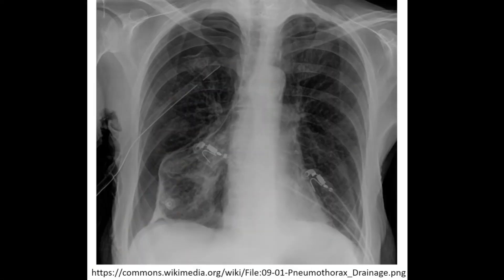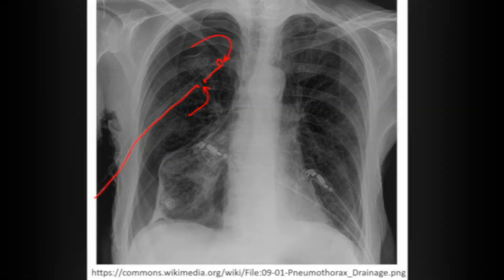Here you can see what a chest tube looks like on a radiograph. You can see the chest tube, and I'll outline the radio-opaque strip that goes down it. Notice there's a little gap — that's because there is a hole at the end and also a hole on the side, which allows air to go in from the tip but also from the side to be sucked out.